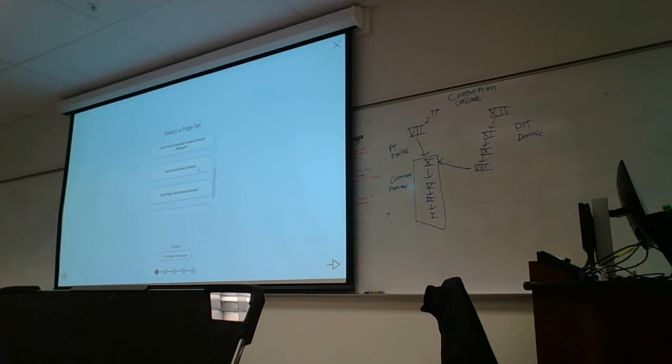The other area that Tobii Dynavox recently did updates to are aphasia page sets, so you'll be able to see some of them that give some picture cues, and there's vocabulary within there that's specific more to adults with aphasia, and there's different grid sizes that you can pick from there. And also a text-based page set that is just text. There's no pictures, so some are more literate users, adult users that can access buttons that only have text on them without any pictures and cues and things like that. So that's how you would pick. So say we pick the aphasia page set.